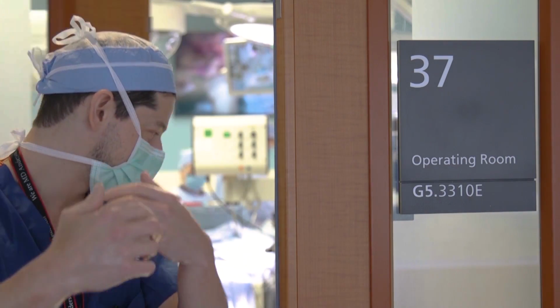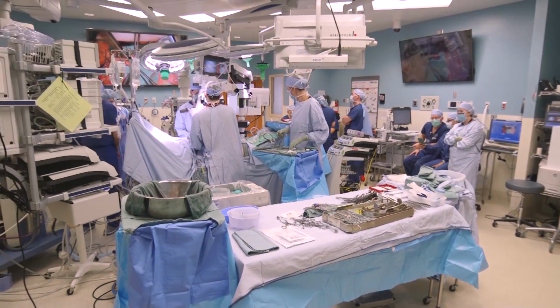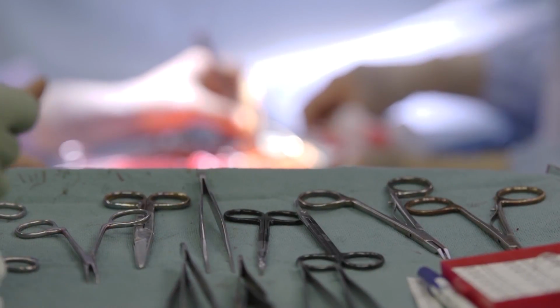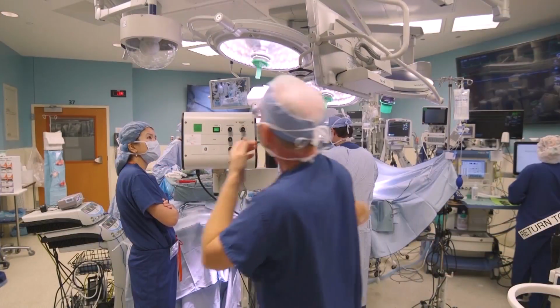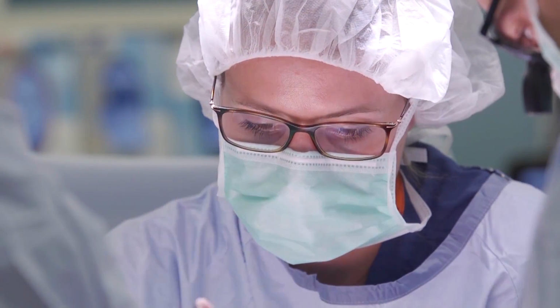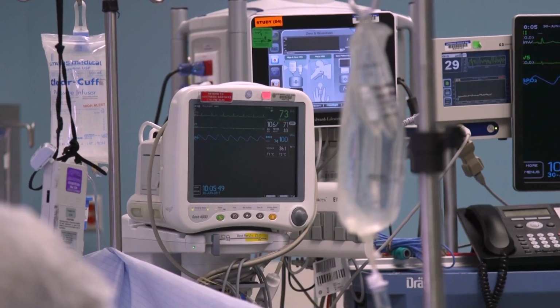If you have had recent surgery, you may have one or more incisions depending on the type of surgery you have had. After some surgeries, blood and normal body fluids may collect in the surgical site, which is also called the wound. Fluids can build up at the site and slow the healing process. They may also interfere with your daily activities and cause discomfort.